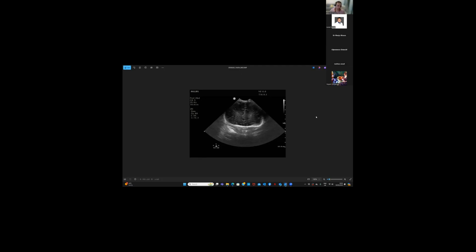And your pediatric abdominal probe, can I just say, I don't think you're using the wrong frequency. How do I know that? I'm just going to annotate your screen if I can. Can you see my cursor? No, I can't see your cursor. No, because I am on another page, that's probably why. Just when you look at the screen, this is really important for everybody who's here.